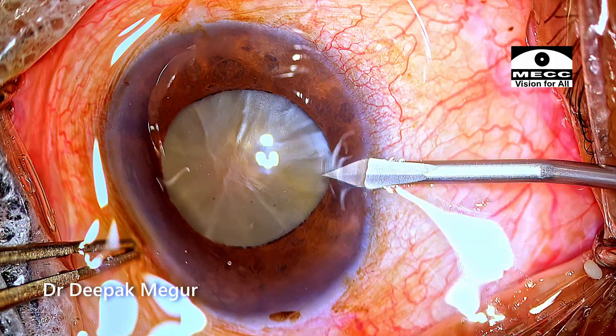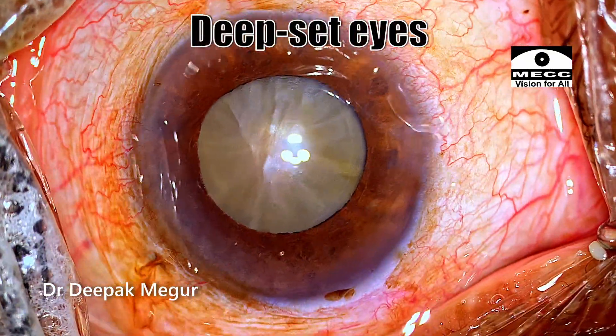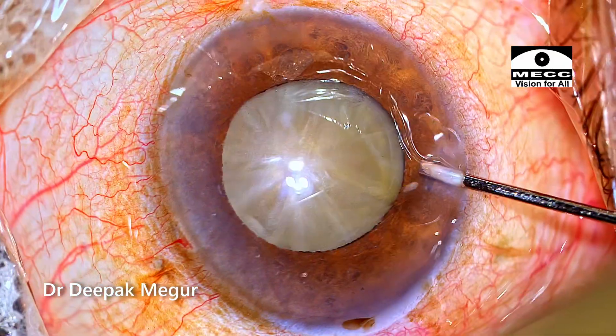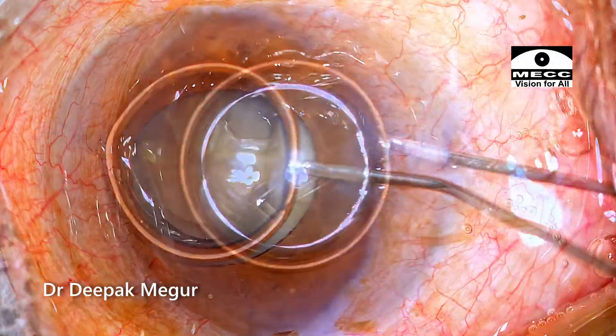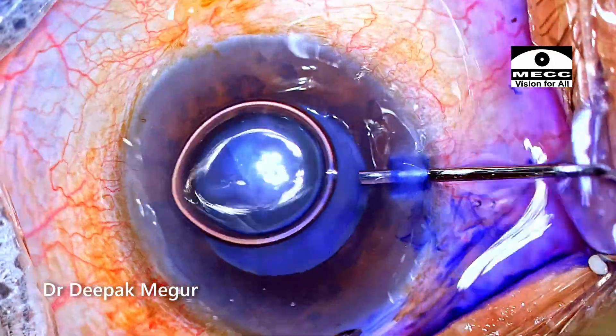The surgery is being done under topical anesthesia. The patient has extremely deep-set eyes, so I would be using my assistant's help to actively suck off all the fluid which is being accumulated. I have used intracameral lignocaine with tropicamide and phenylephrine combination, which would help me to get better intraoperative mydriasis.